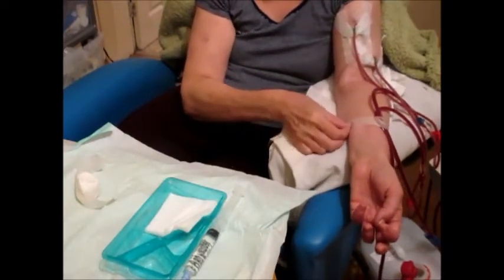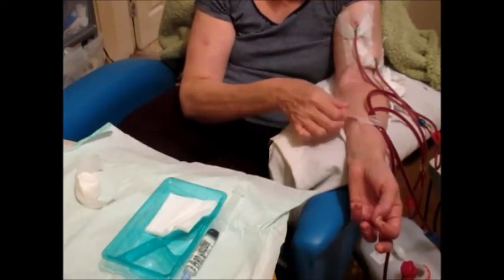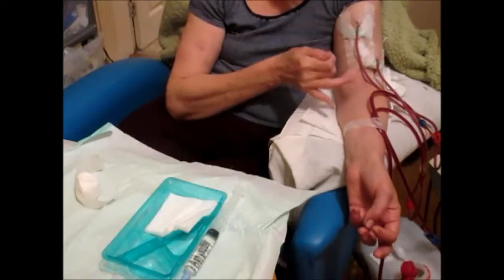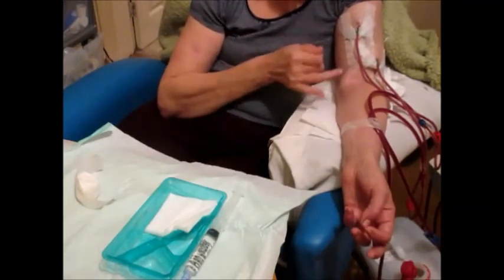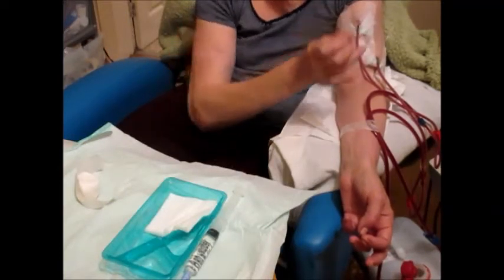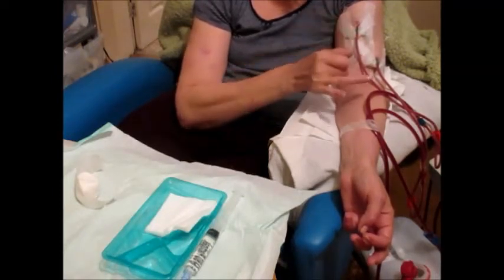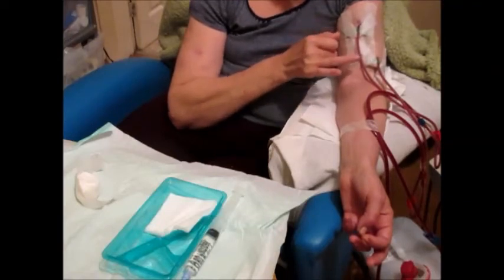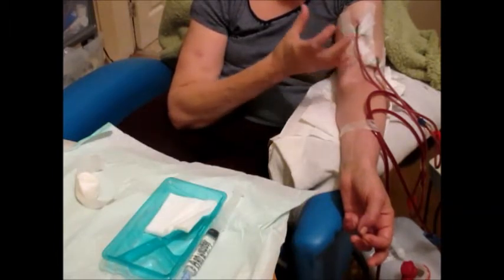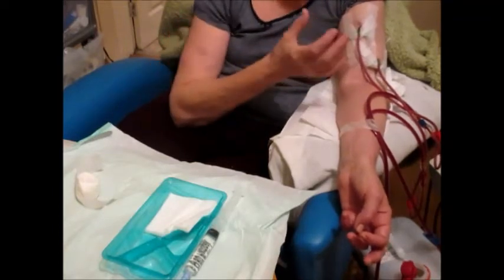The other thing I forgot to mention earlier in the video is the fact that I use what's called a rope ladder technique for insertion of the needles. All that means is that I am using sharp needles to actually rotate up and down the access, which helps prevent developing problems with the access and excessive bulging of the access as well.